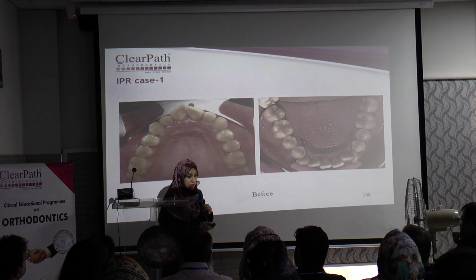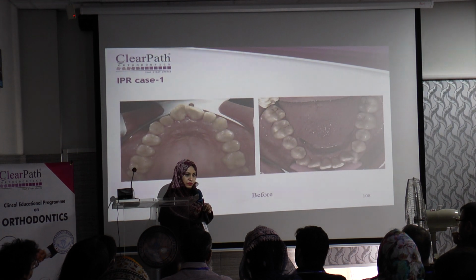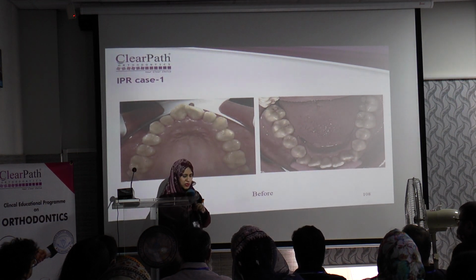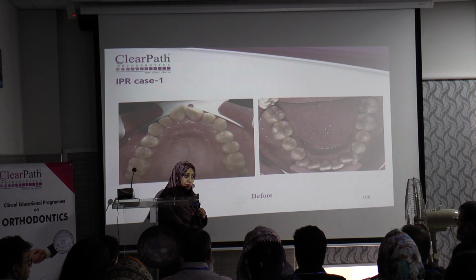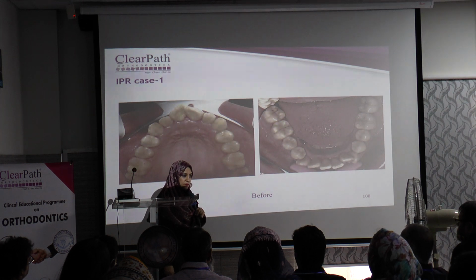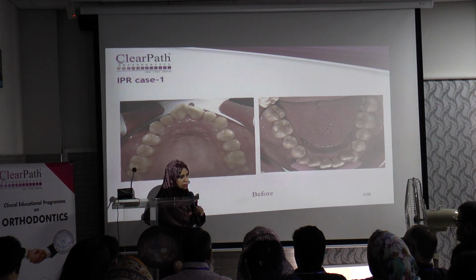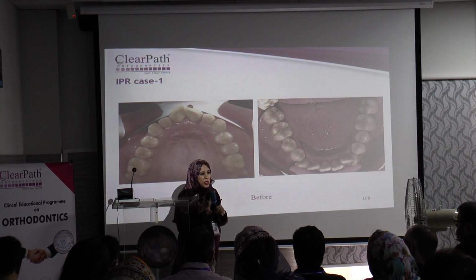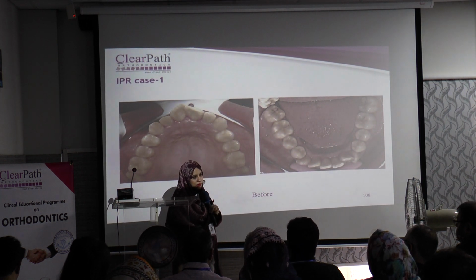Aligners, sir? Yeah, we can. Most widely we do this. No, we do dental expansion. Skeletal expansion is not this. Yeah, it can be done if you doctors want it. Suppose the lower is blocked out with it, of course it cannot be treated with aligner. So lower we can go for fixed and upper one we can give you the removable aligner.